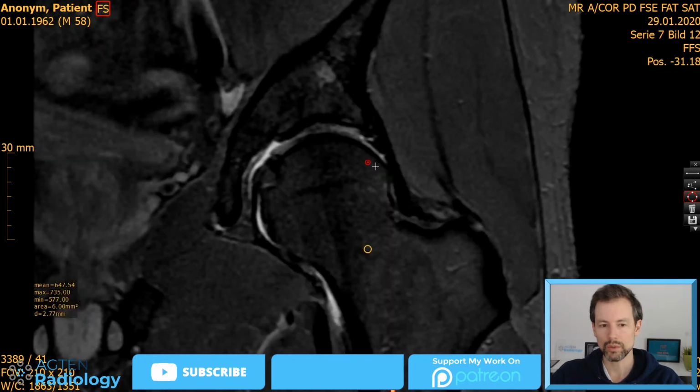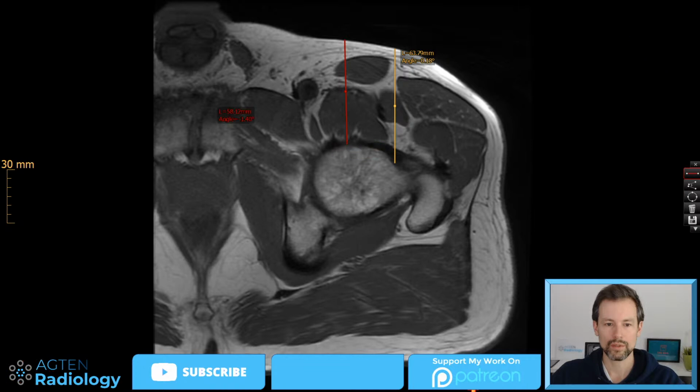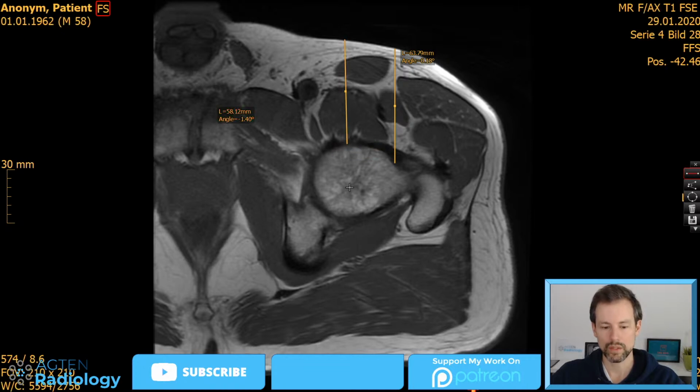And this is also a very good approach if you have very thick patients. For example, if you have a very adipose patient, and you think about where you put your needles in, if you go to the neck, you need a longer needle than when you go to the head. That's just one thing. And sometimes 12 centimeter or even 17 centimeter spinal needles are not enough to reach the joint here, so you can then go to this approach. That's one question.